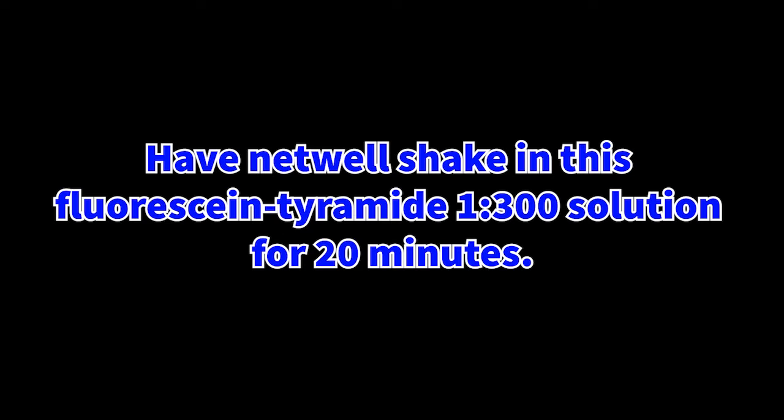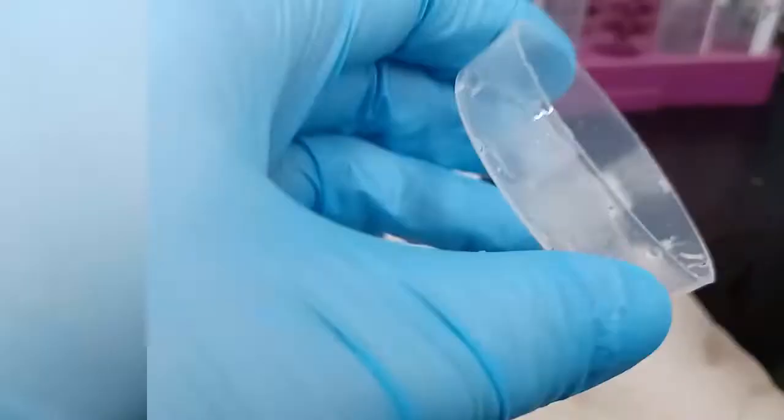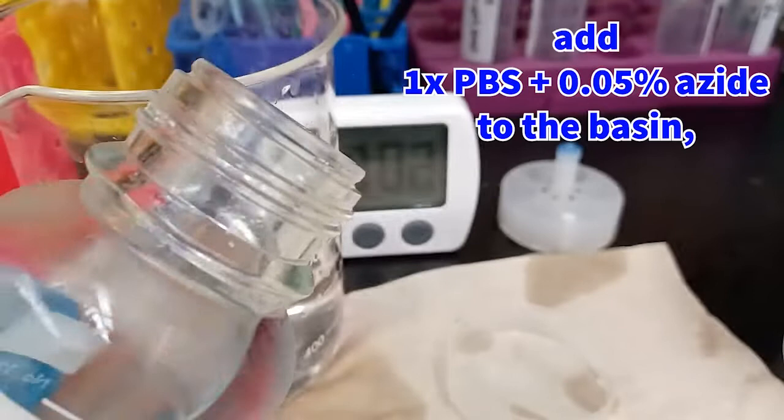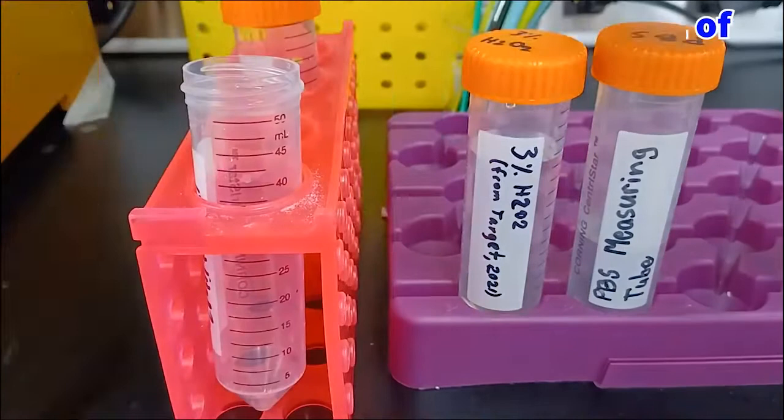Leave the netwell to incubate in this fluorescein tyramide solution on the shaker for 20 minutes. Afterward, discard the fluorescein tyramide from the basin into non-hazardous waste. Add 1x PBS plus 0.05% azide to that basin and place back on the shaker for 10 minutes in order to deactivate the HRP from the previous antibody step.